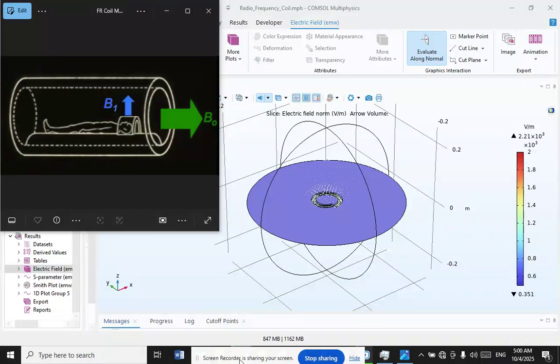There is very little radio frequency interference produced by the MRI machine. The reason for this is that the MRI is a poor radio transmitter and lacks an antenna. The radio frequency electromagnetic field produced in the transmitting coil is a magnetic near field with very little associated changing electric field components, such as all conventional radio wave transmission has.